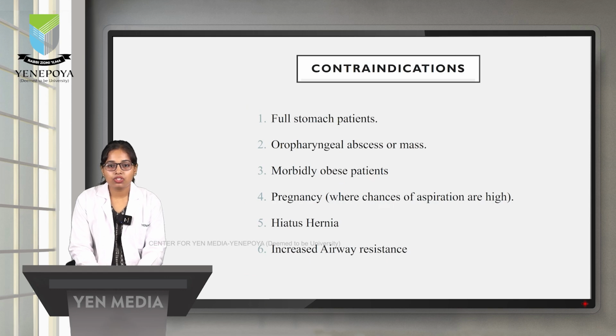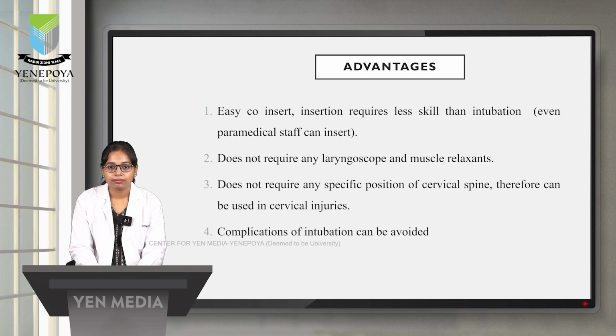The contraindications of LMA are full stomach patients, oropharyngeal abscess, morbidly obese patients, pregnancy where the chances of aspiration are high, hiatus hernia, and increased airway resistance.